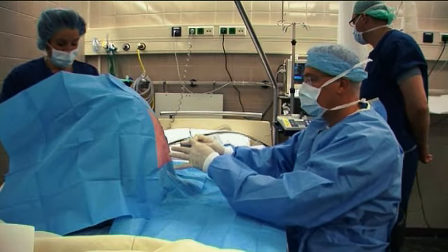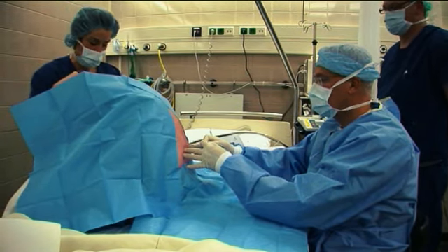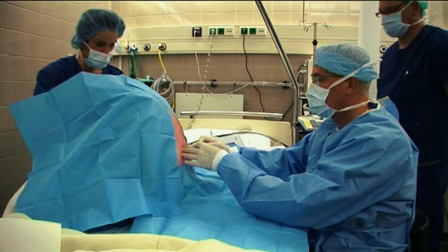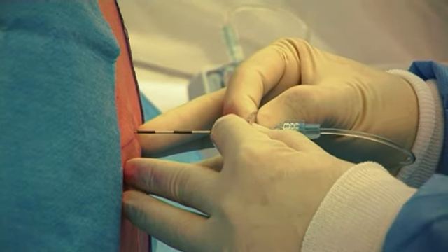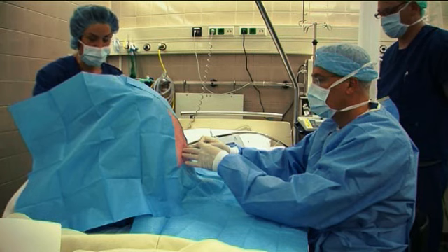When working with the APAD, the anaesthetist can manipulate the needle with both hands, no matter the level of the puncture. In this way, he has better needle control. As soon as the needle penetrates the skin, the pressure starts to rise. The anaesthetist inserts the needle towards the epidural space, and in the meantime concentrates on what he feels and hears.